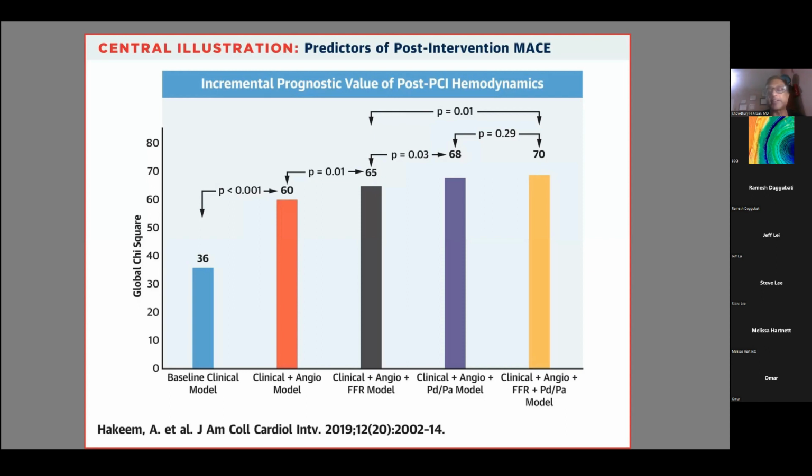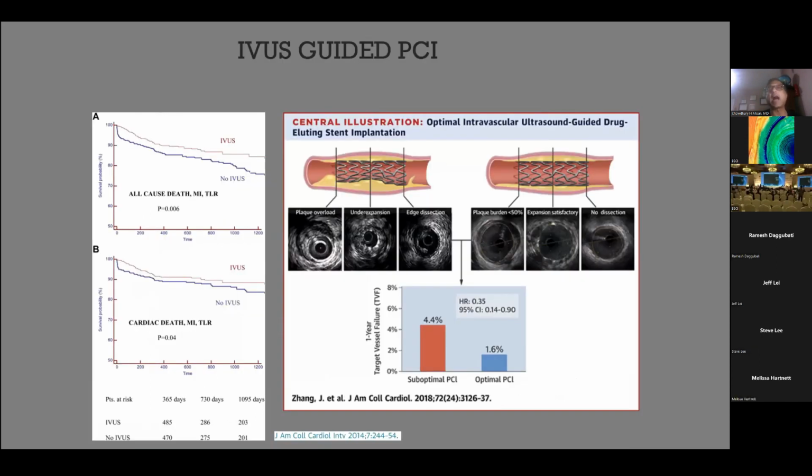percutaneous coronary intervention assessment, in terms of from basic baseline clinical to a vigilant angiographic post PCI pictures, and then add tools like physiology and anatomy, then we get the best results. IVUS, or intravascular ultrasound, or now we are using optical coherence tomography.